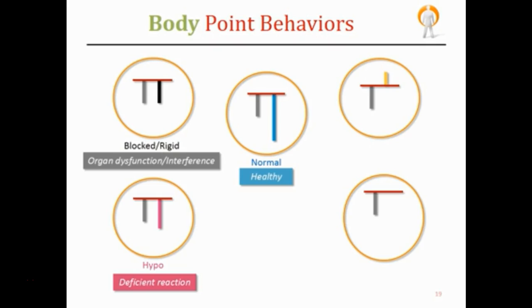Paradox regulation means that the response is opposite to the normal response. So for the body points, it means that the second temperature warmed compared to the first temperature, which is a reflection of an inflammatory response, meaning an underlying process of inflammation.